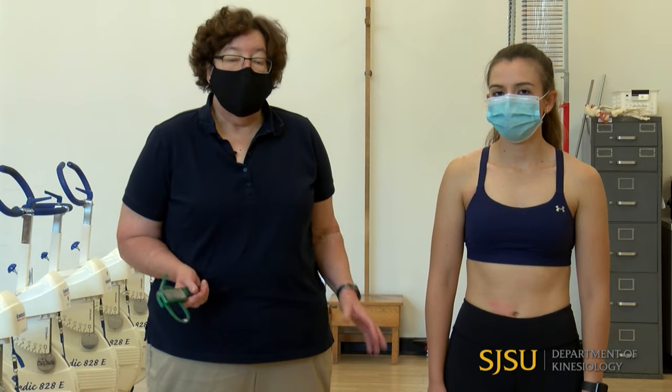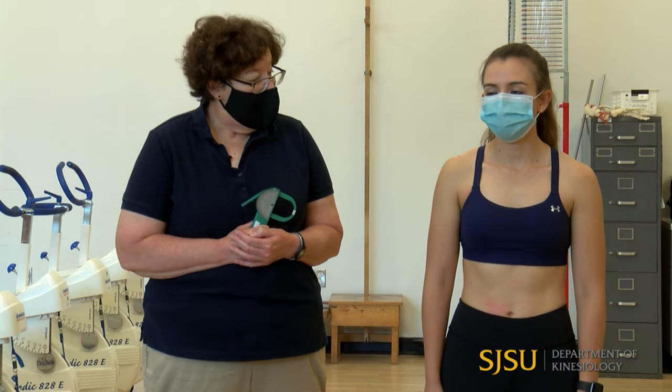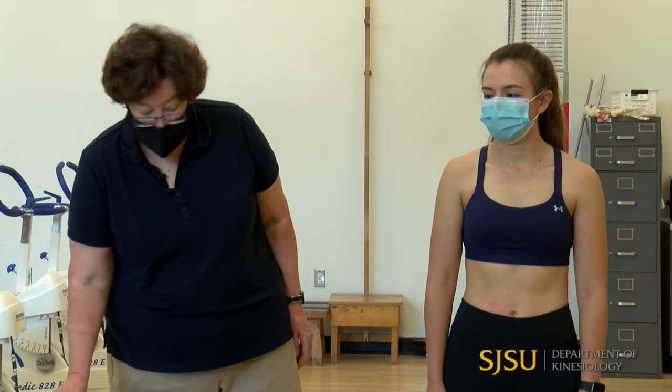All of the skinfold measurements are done on the right side of the body — that's the standardized technique. There are two different locations for a number of skinfolds depending on which prediction equation you use. If you're using a Jackson equation, you must use the Jackson sites. If you're using any other author's equation, you use the standardized sites. When there's a difference, we'll show the standardized site first and then the Jackson site.